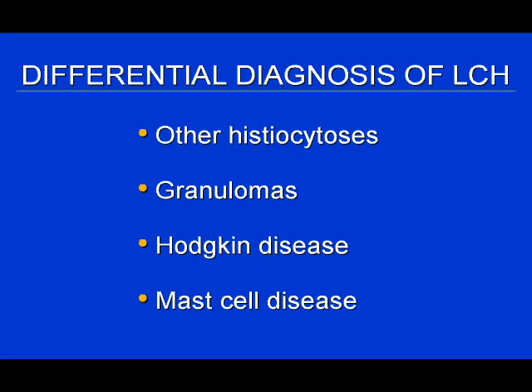All right, what's our differential diagnosis of Langerhans cell in the marrow? Well, granulomas, interestingly enough, because they've got a lot of histiocytes, and particularly if you're suspicious of Langerhans cell histiocytosis and counter granulomas, you'd want to stain it to rule it out. Other histiocytoses, including perhaps in children, some of the storage diseases we've discussed, and the disease we'll discuss next, which is hemophagocytic syndromes.